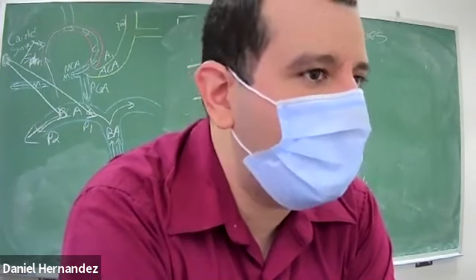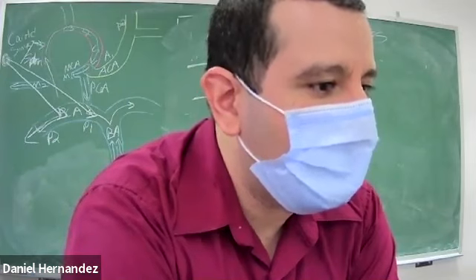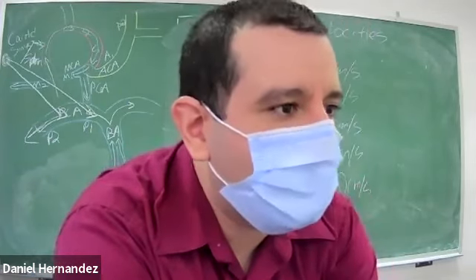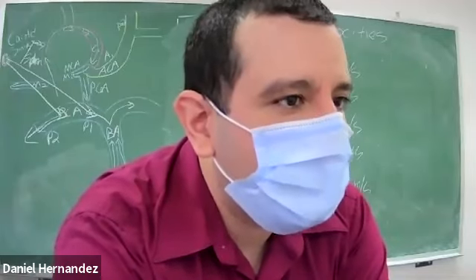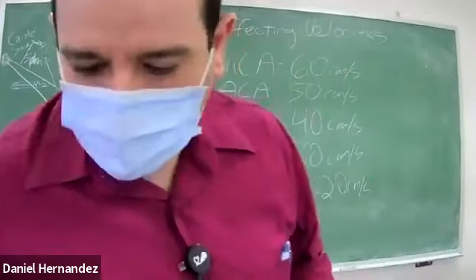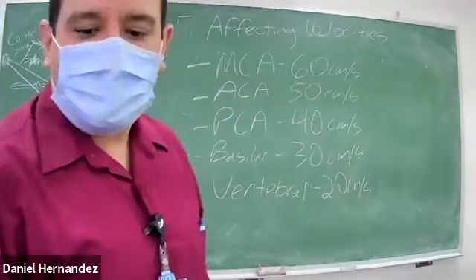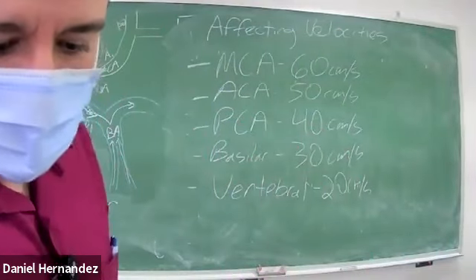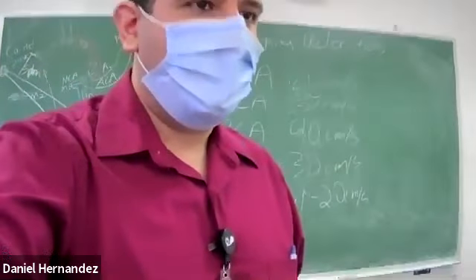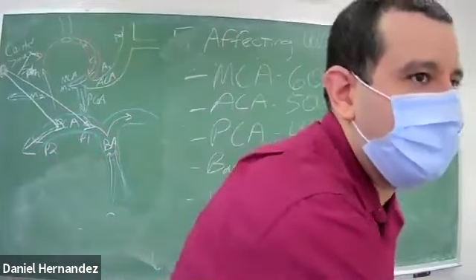So I'd rather take our time and do that properly over the summer and not bombard you with a lot of pathology. So at least when you get into doing your transcranial Doppler rotations in the hospital, you can understand your windows, understand which vessels you're imaging from the windows and your normal velocities. I think that's a good foundation. And then we'll get more into the pathologies during the summer.